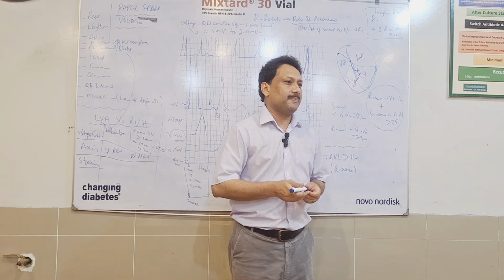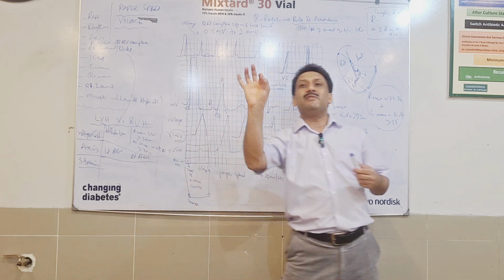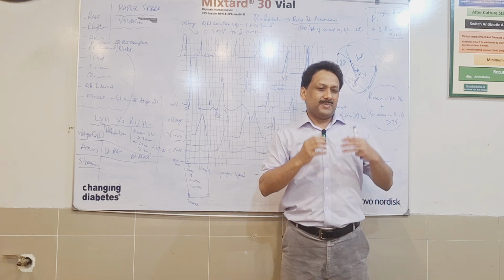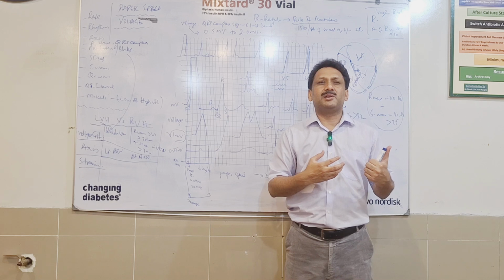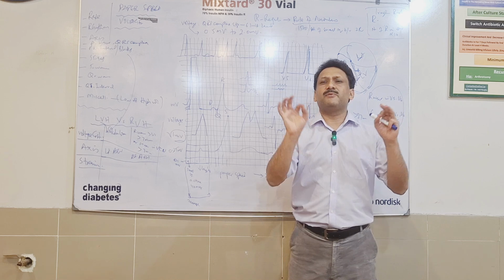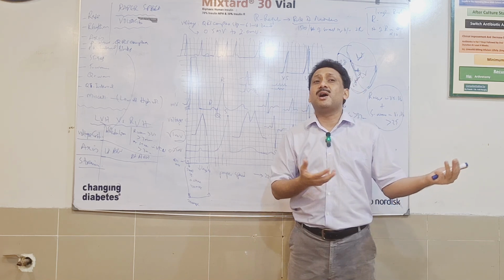And then strain. I already told you while we were discussing the T waves that as the pressure goes high in the heart chamber, there is a high pressure state within the ventricular chambers. The high pressure states are usually three: aortic stenosis, hypertrophic obstructive cardiomyopathy, and hypertensive heart disease.